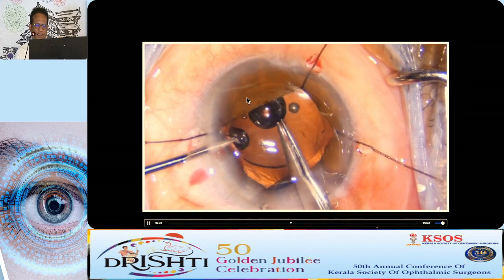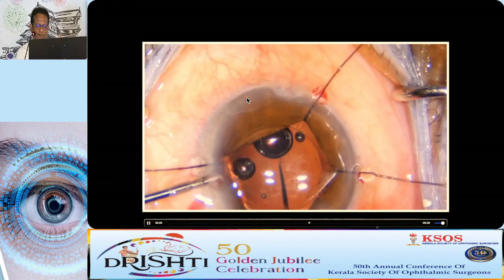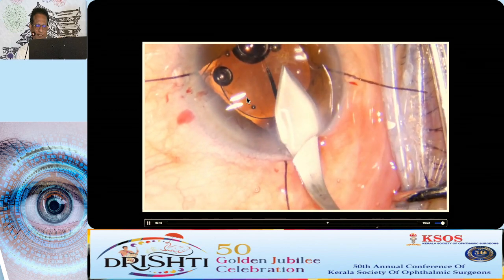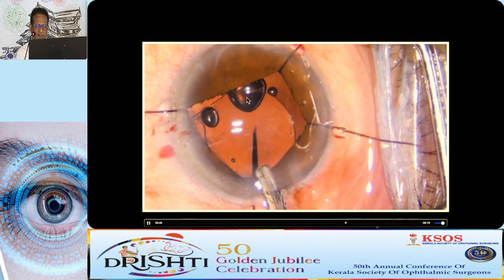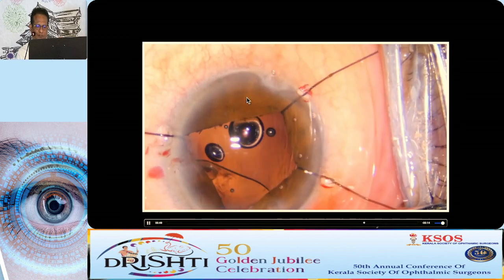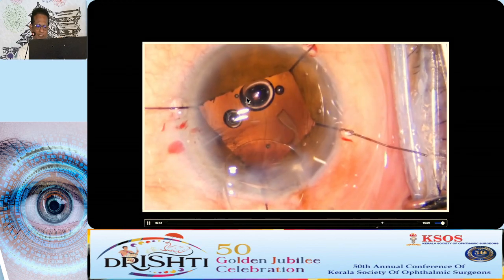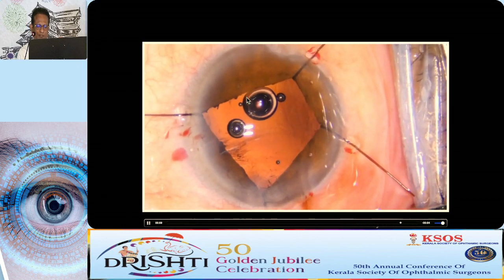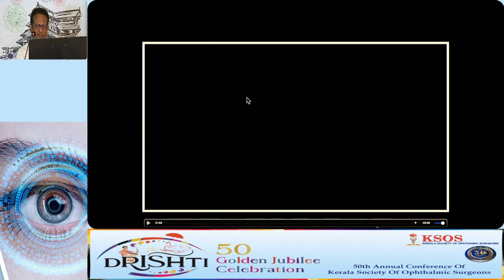Here the lens is being divided partially. Three-quarters of it is being cut with serrated strong-bladed scissors, and slightly the wound is extended, and you can see a firm lens holding forceps is introduced through the tunnel, and the lens is rotated, with each half of the lens being carefully removed from the bag and outside without damaging the capsule.